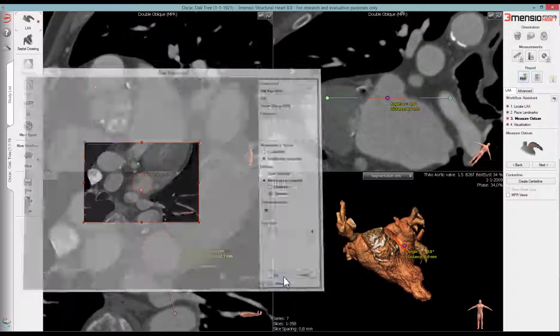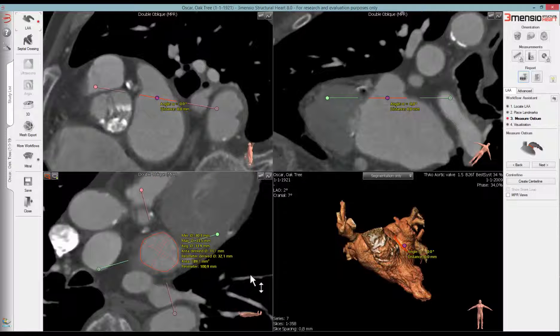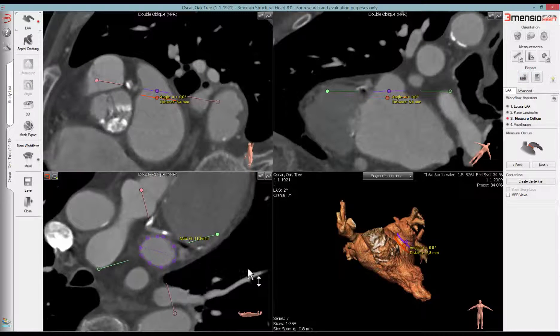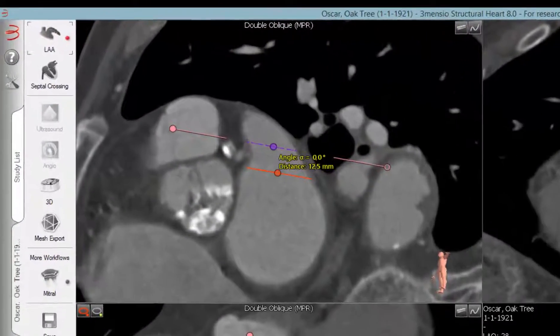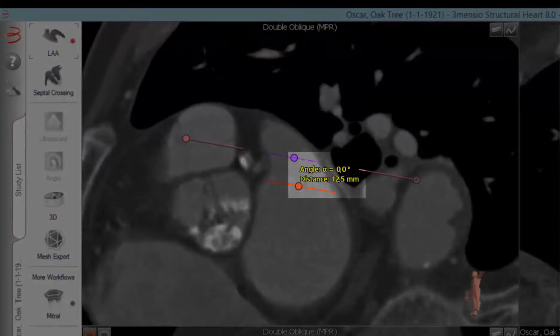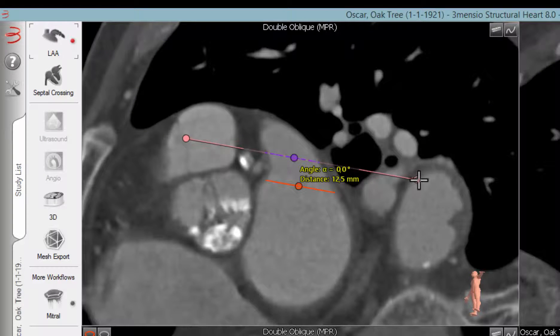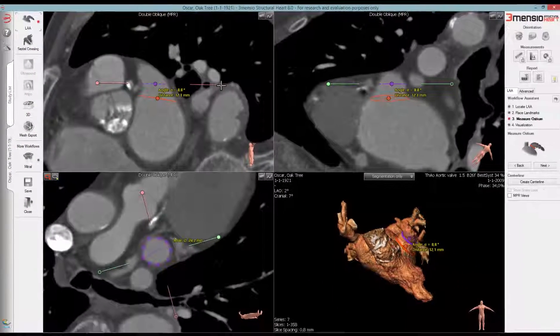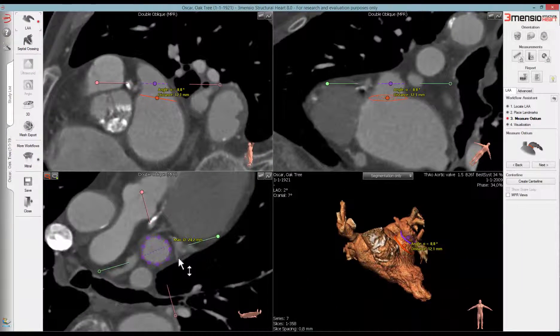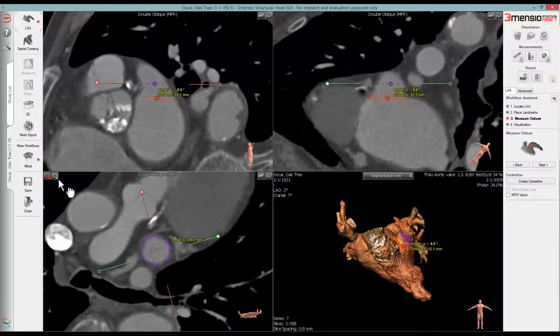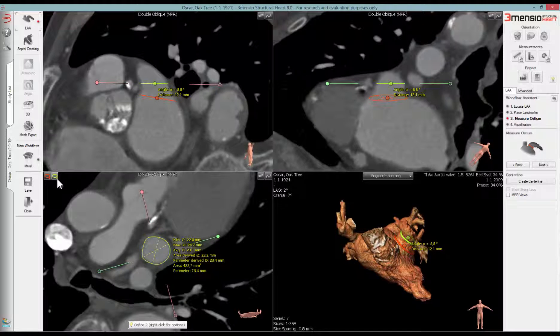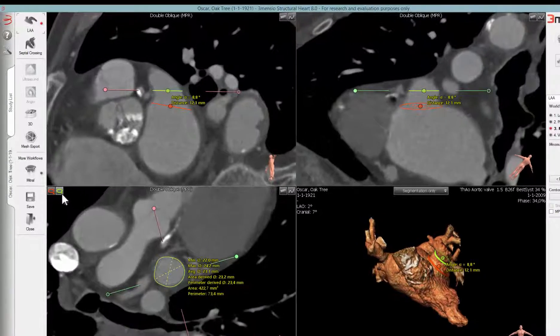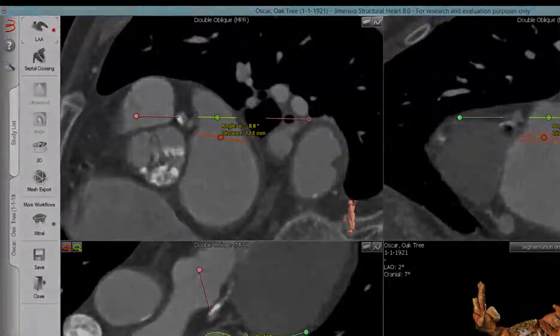To measure the landing zone, move into the LAA. The distance between the placed ring and the current position is displayed in the top views. Change the angulation of the plane if necessary, then check the segmentation in the perpendicular view. Once correct, click on the second ring in the top left corner. It is also possible to measure the depth of the LAA using the ruler measurement on the right.